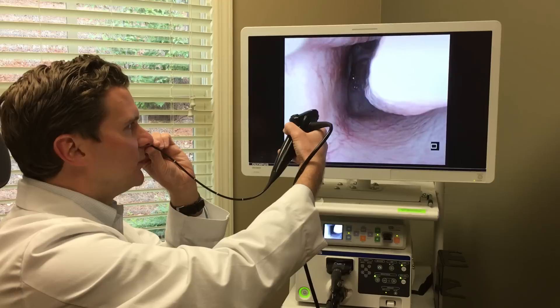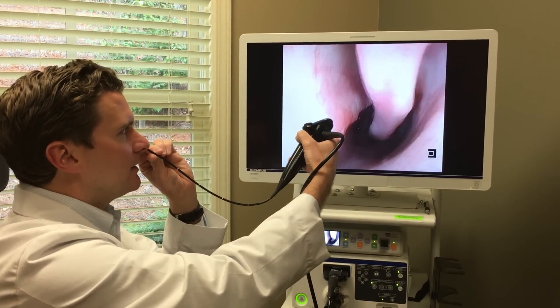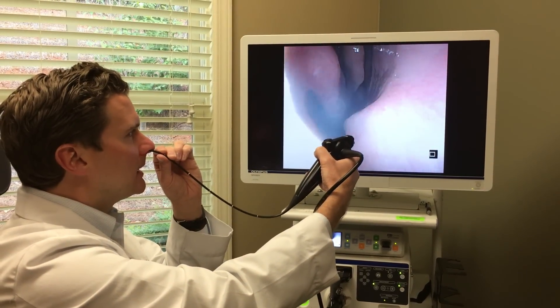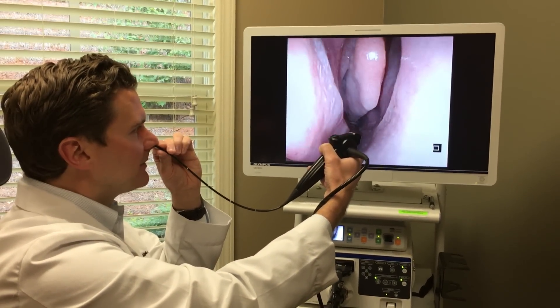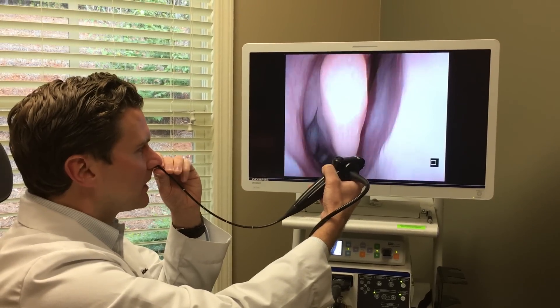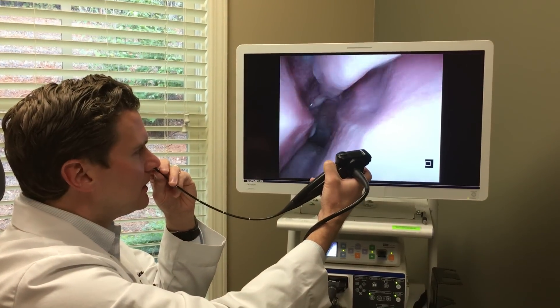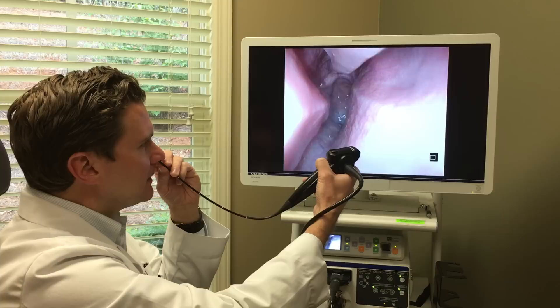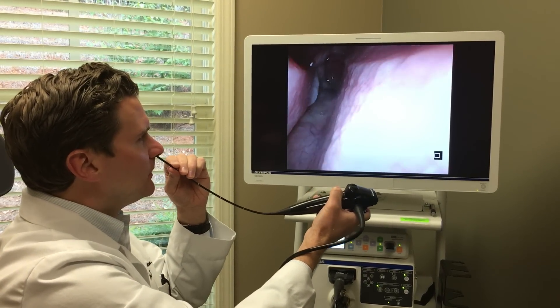You can see my soft palate moving in the back of my nose there. If we go over to my other side, again you can see my inferior turbinate. Definitely my septum is not in the way as much on this side. You can see my middle turbinate there. I'm gonna kind of squeeze through here — it's a little bit tricky to do it on yourself because things are backwards, but we will try.